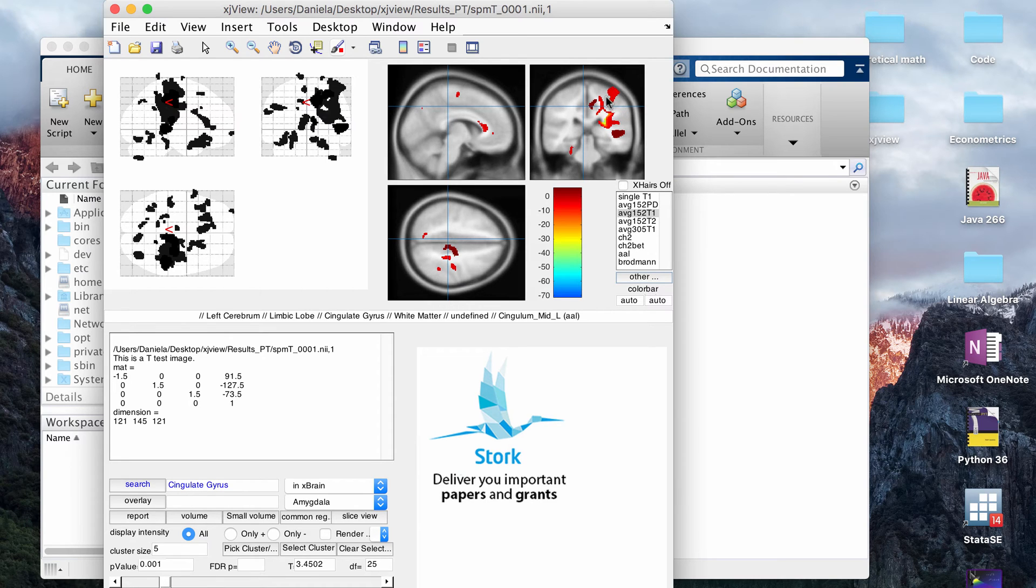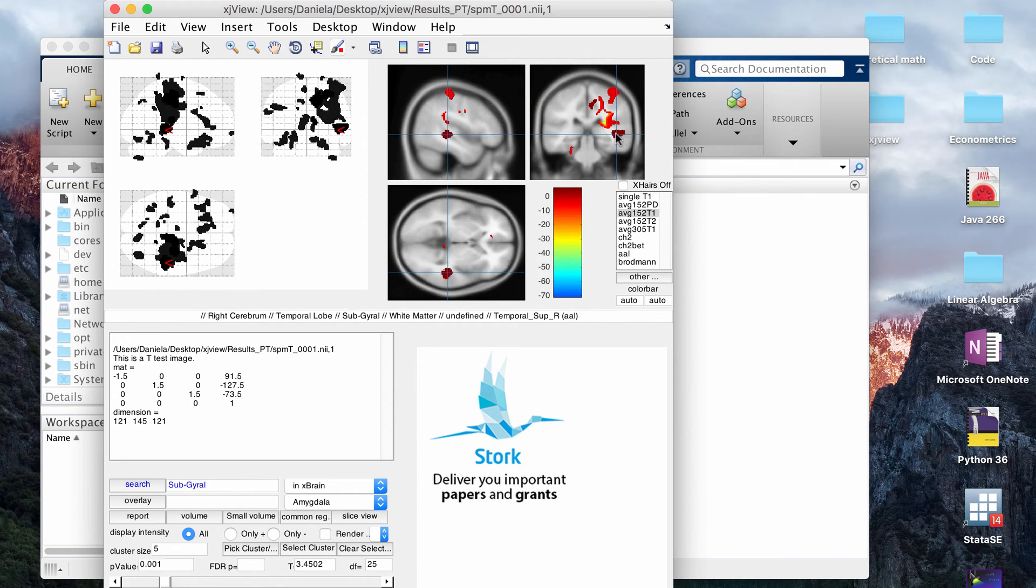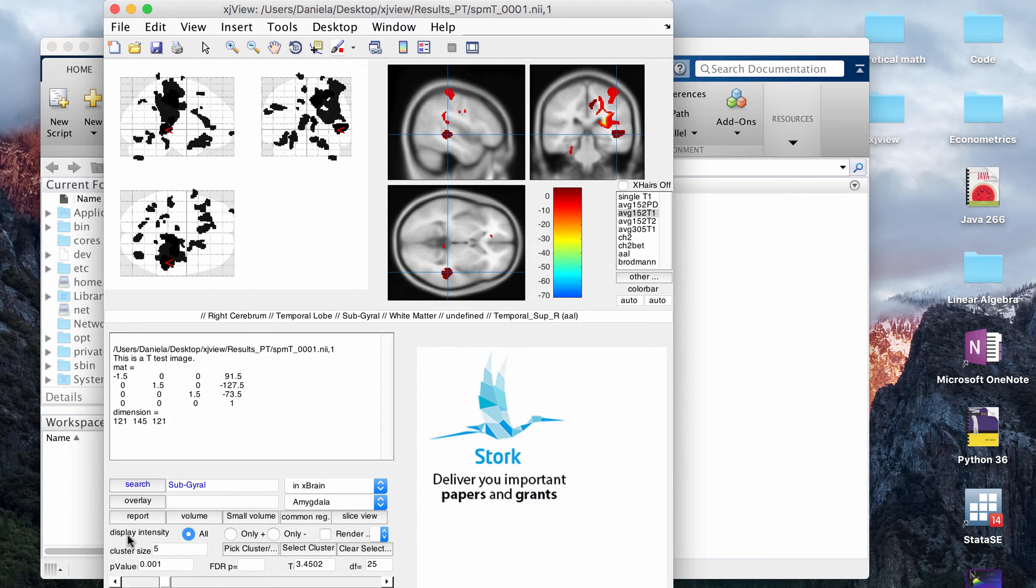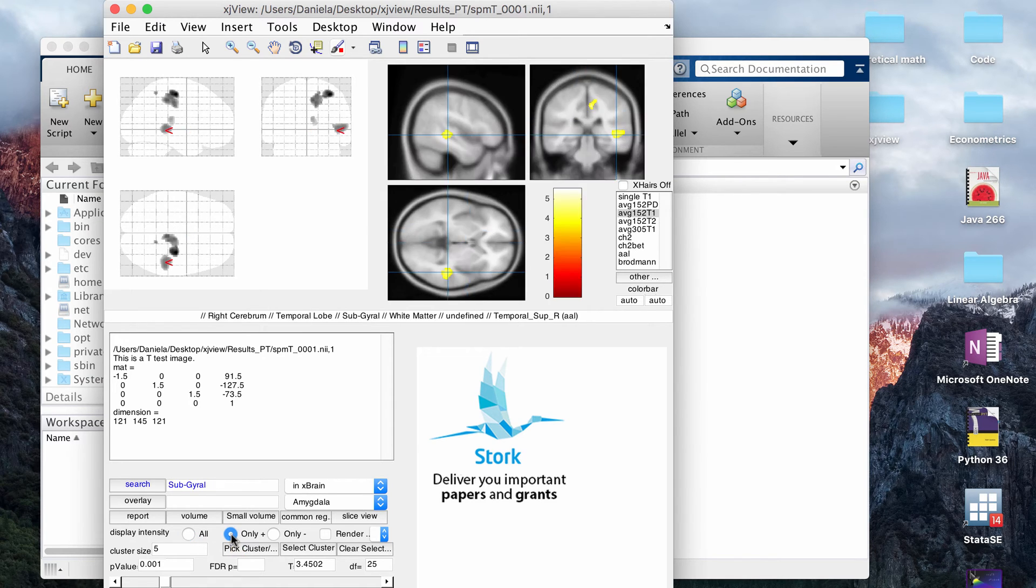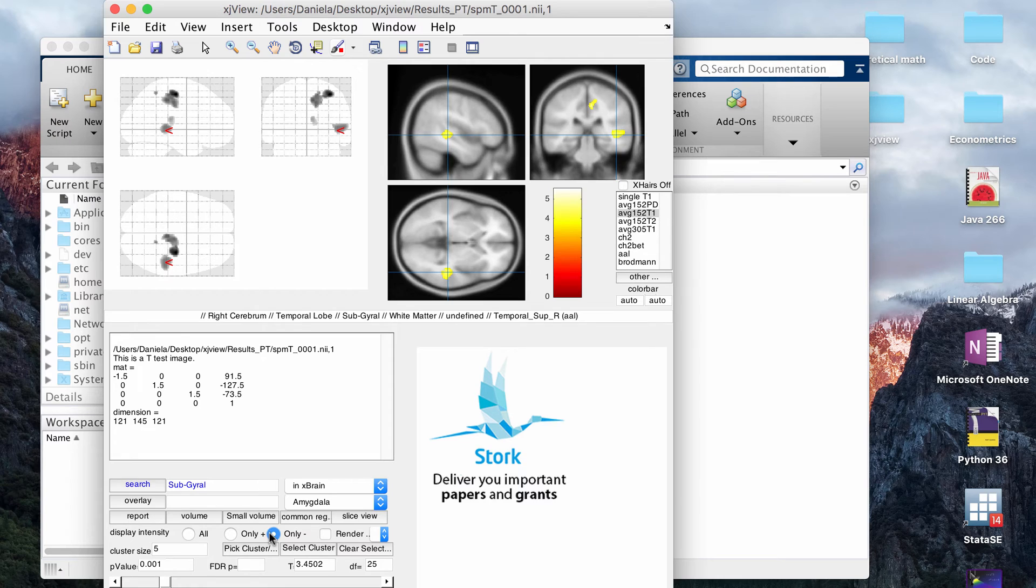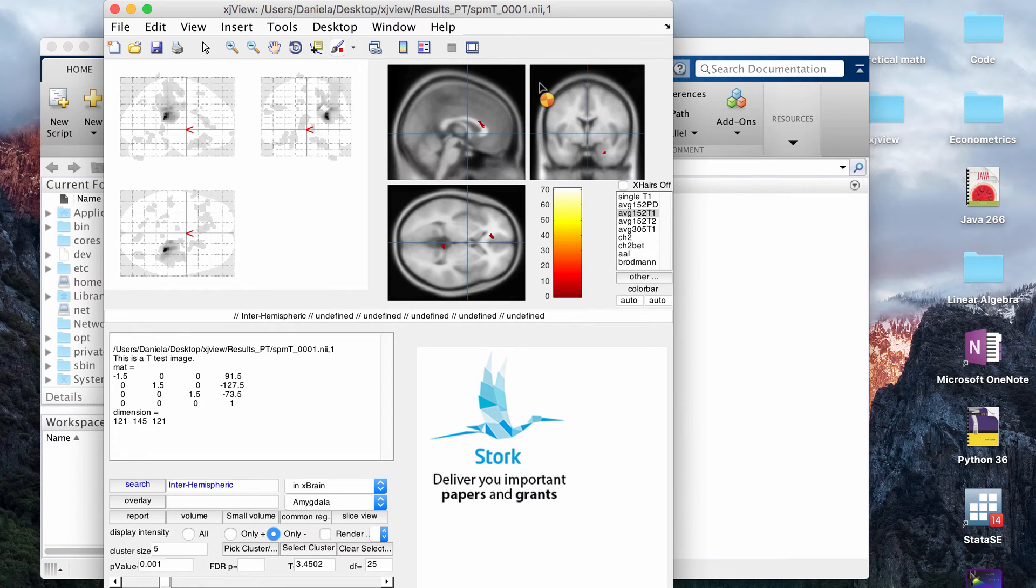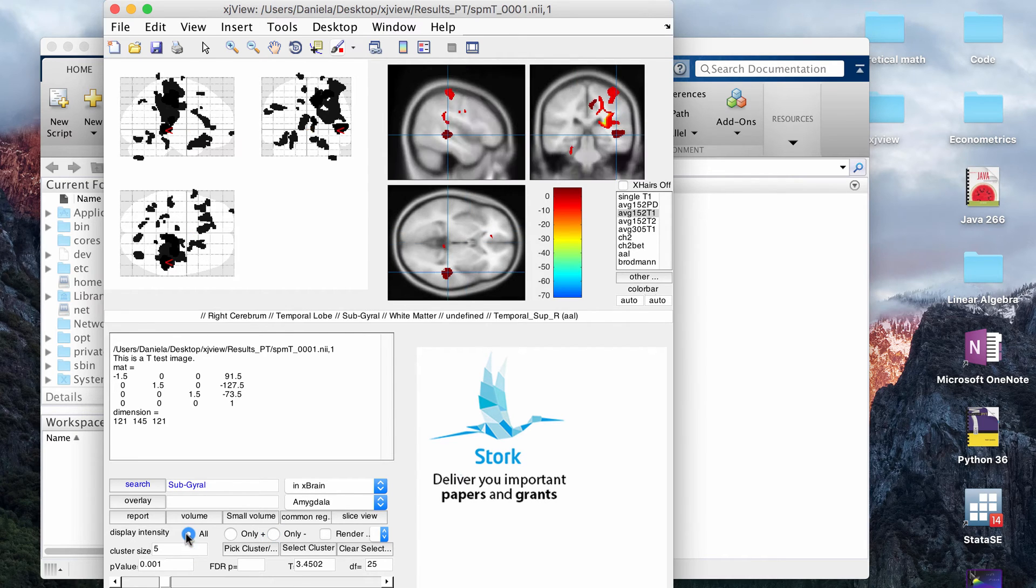When you're looking at this for VBM, you can see that most of these values are negative. You have some positive values, so if you want to discern positive from negative, you go down here and it says display intensity. You have the option to view positive and negative clusters. You can view just positive clusters. That will change the map in real time here and here, and now you can see, like I said, the positive values go from about zero to a little bit less than five. If you click only negative, it will update again and show you the schizencephaly, which we would expect to be negative compared to controls. I'm just going to undo that and click all again.